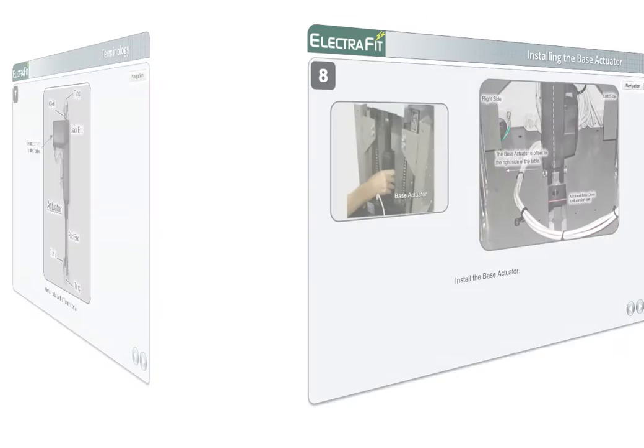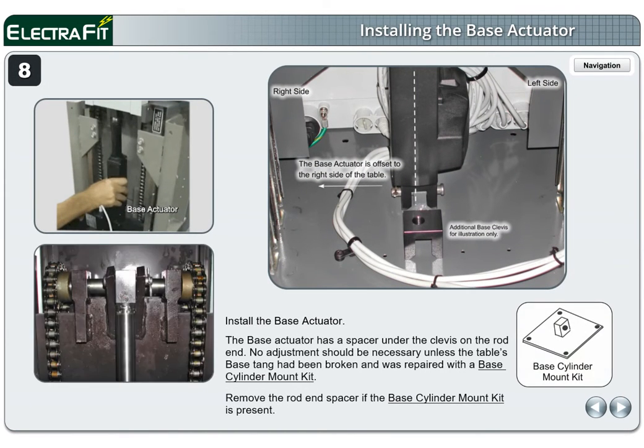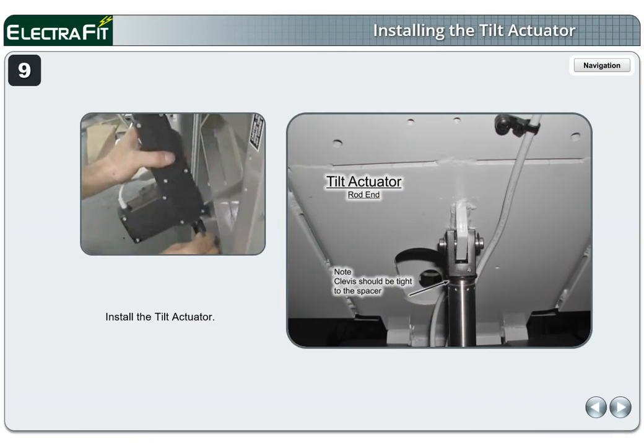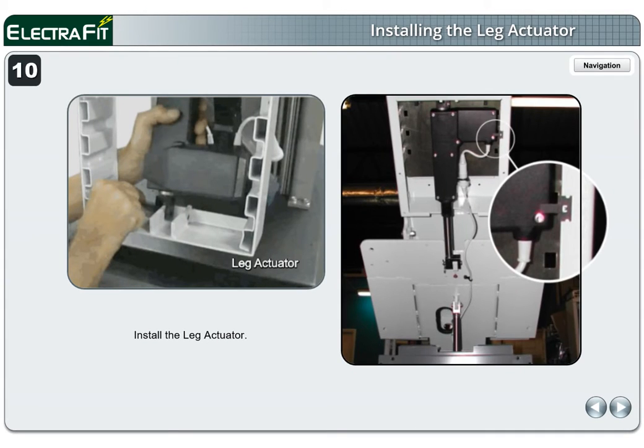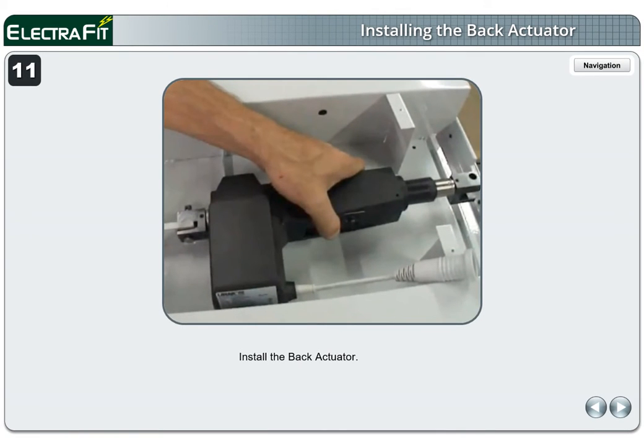Pages 8 through 11. Install the base actuator. The base actuator has a spacer under the clevis on the rod end. No adjustment should be necessary unless the table's base tang had been broken and was repaired with a base cylinder mount kit — remove the rod end spacer if the base cylinder mount kit is present. Install the tilt actuator. Install the leg actuator — note the placement of the clevis. Install the back actuator — note the placement of the clevis. Only insert the back end clevis at this time.